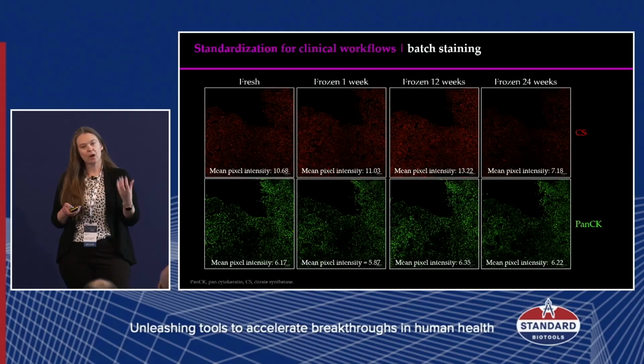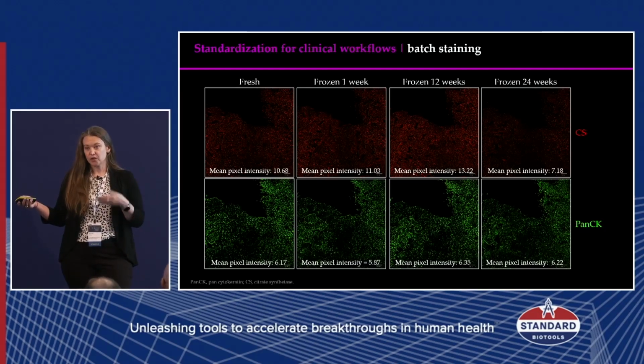The second thing was, we talk a lot about stain stability, but what does that really mean? If we were going to acquire this over 218 days, some of those slides are sitting there a lot longer before acquisition than the initial ones. So how stable is that stain?